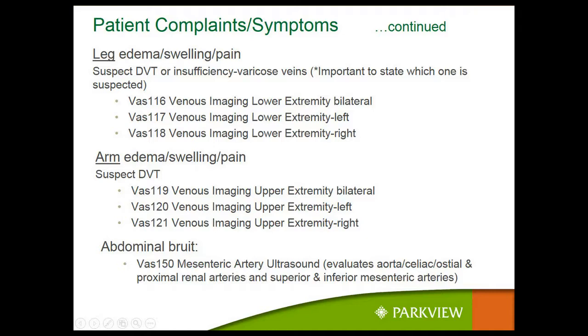And so what we're watching is that when we squeeze, that blood flow shoots up, and then if the valves are working, that blood flow stops. It does not go back down to their leg. If they have insufficient valves, what happens is we squeeze, the blood flow goes up, we release, and you can see it on the ultrasound machine, it just whoosh, and that blood flow is flowing right back down because those valves aren't working.